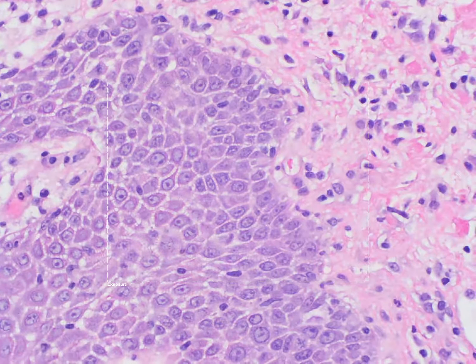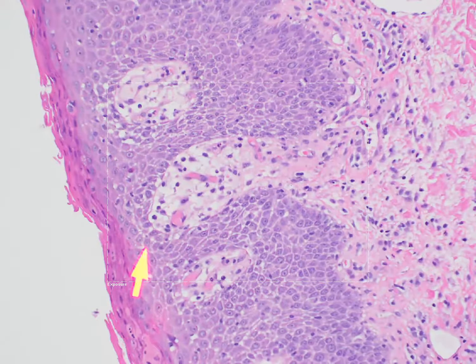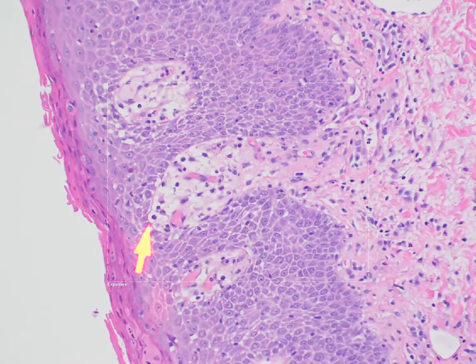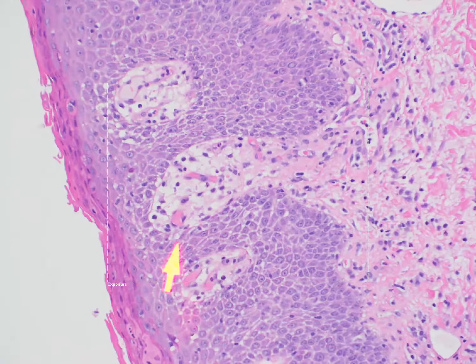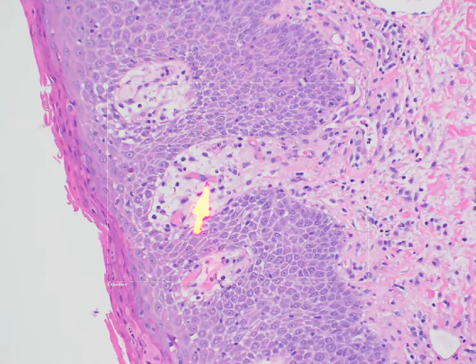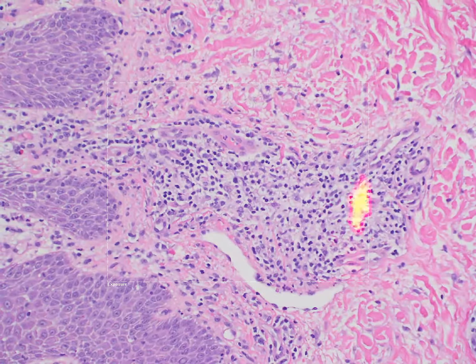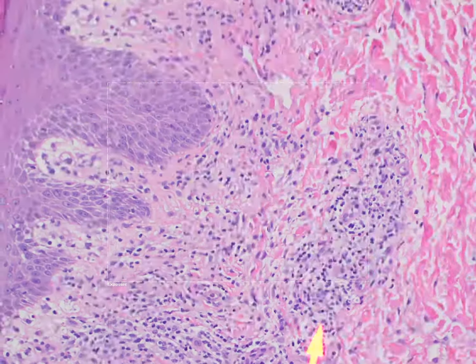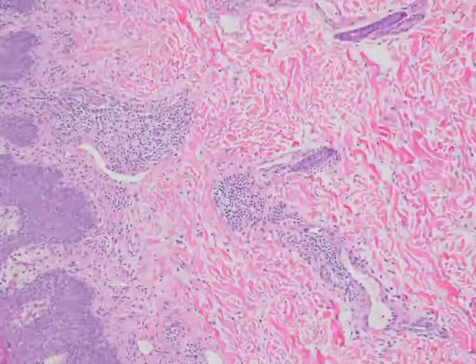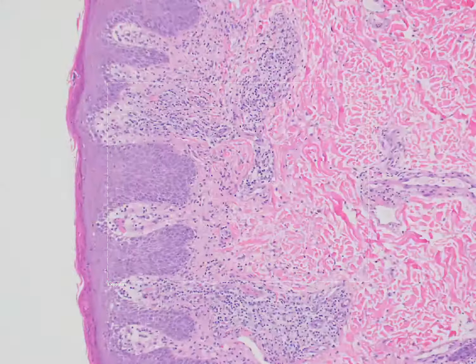I want to introduce the structure called the suprapapillary plate, which is the portion of the epidermis that sits above the papillary dermis. And in this entity, it's thinned. And then in the papillary dermis, you have dilated blood vessels that are congested. And then you have a patchy perivascular and interstitial lymphocytic infiltrate. This happens to be an example of psoriasis, which is the prototype for the psoriasiform reaction pattern.